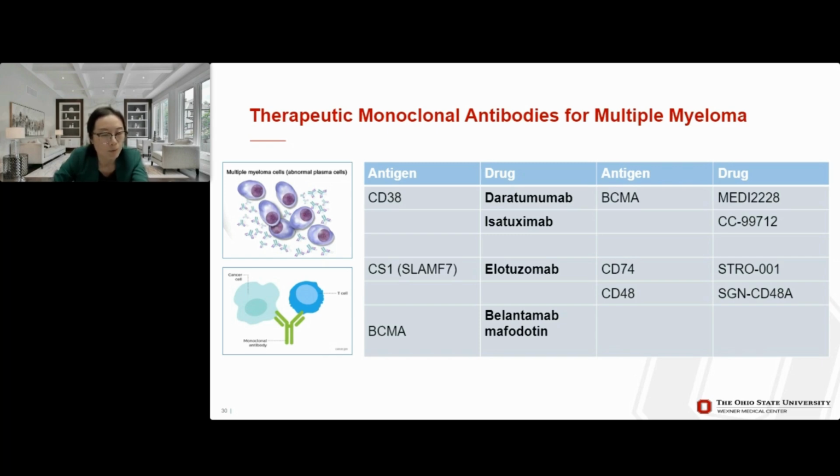The appearance of such a new M protein is only relevant if it causes unnecessary additional investigations or leads to incorrect conclusions of less effective therapy. In general, the main concern with the presence of this therapy is misclassification of disease response. The drugs listed here are FDA-approved drugs, and they are all monoclonal IgG kappa.